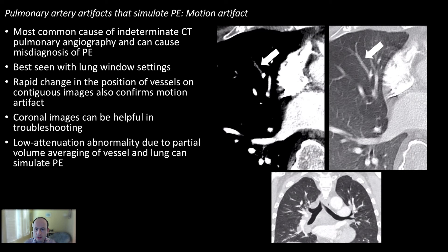Here is an example of motion artifact causing an apparent filling defect in a pulmonary artery branch. It appears somewhat well-defined on mediastinal windows, but on lung windows you can see a double appearance of that pulmonary artery — simply motion artifact. My practice is: when I see a filling defect, unless it's very well-defined, I go to lung windows to make sure there's no motion. Coronal imaging can also help since motion can occur in the cranial-caudal plane. Multi-planar reformats are very helpful.